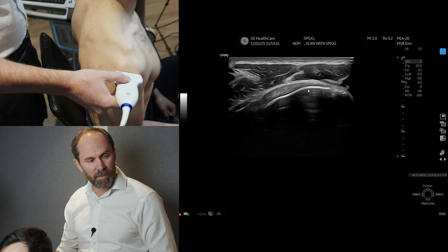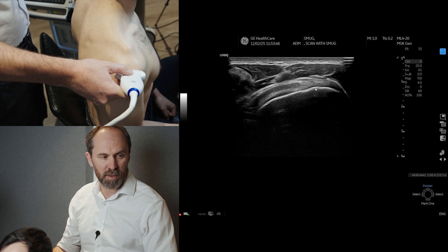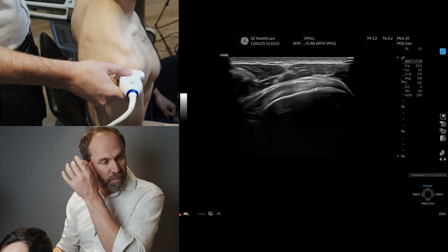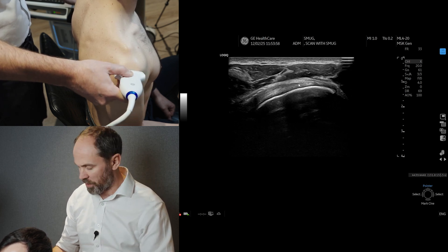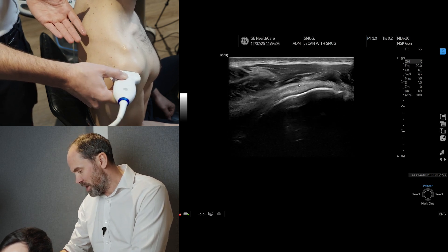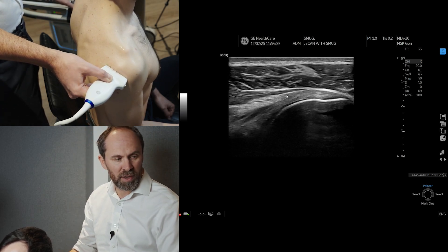If you then come up and bring the wire up with you, you're going to see the infraspinatus attaching into the back of the tuberosity — the posterior aspect of the greater tuberosity. Now if we want to look at those fibers, remember we need to heel and toe. Then we can slide the probe round, but remember we must push down the medial side of the probe as we go, and we can line up with these fibers here.